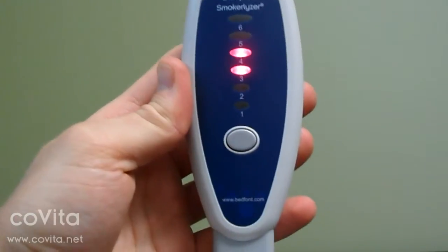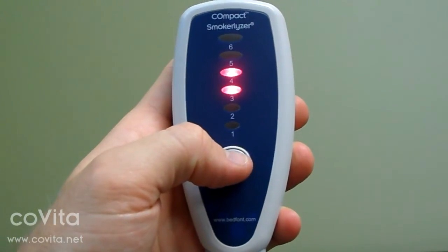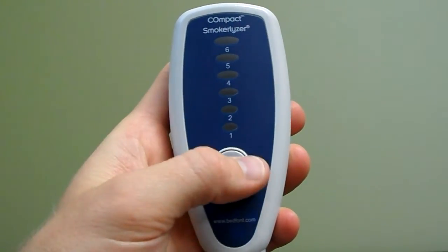To begin a new test, either let the compact cycle off or press and hold the button until all the lights go off. Then press and release the button to turn the compact back on and the 15 second breath hold countdown will begin.